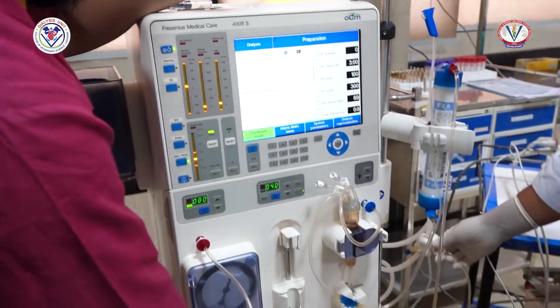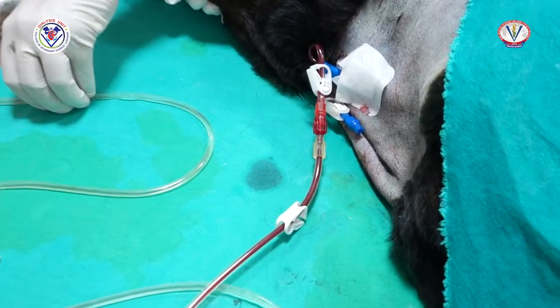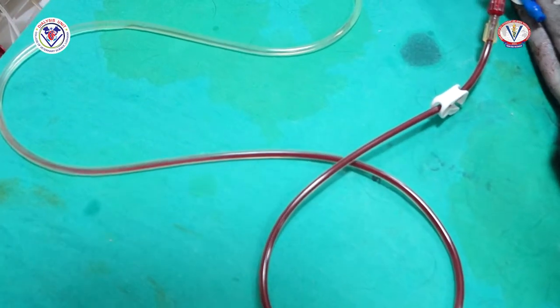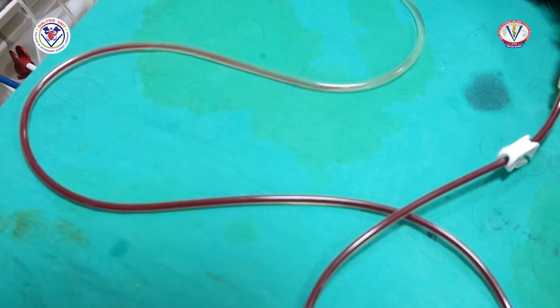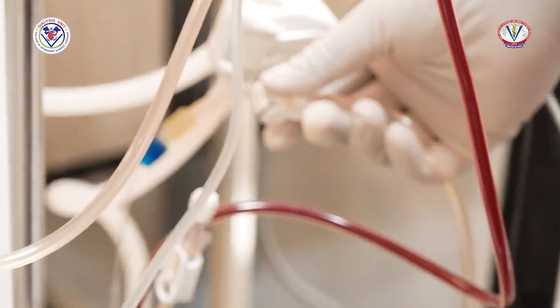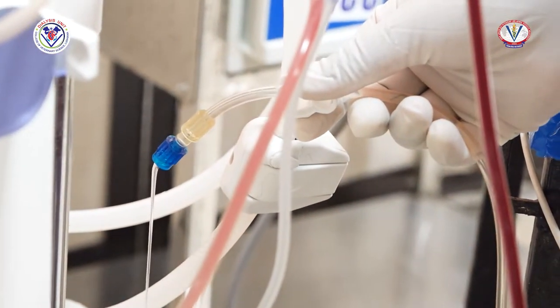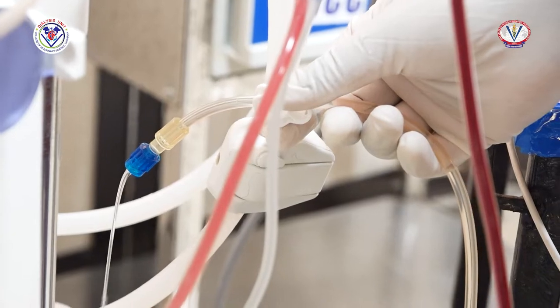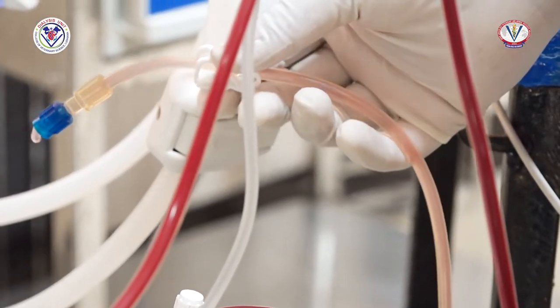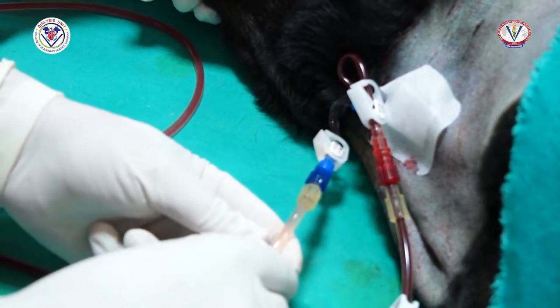Start the blood pump. Initially, the speed of the blood pump is kept low until the blood enters the dialyzer and passes through the venous chamber. Make sure to remove the heparinized priming normal saline solution by discarding it. Once blood reaches the other end of the venous line, stop the blood pump and connect the venous line with the venous port of the catheter.